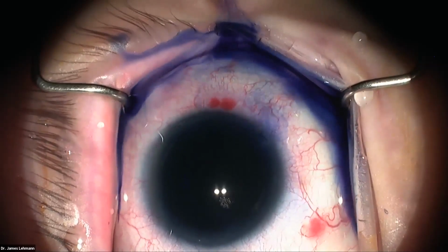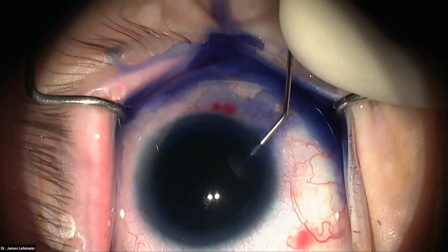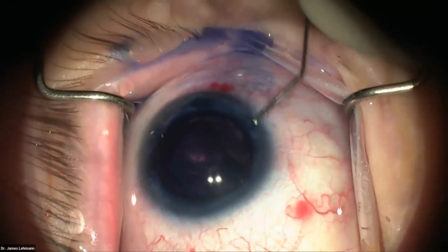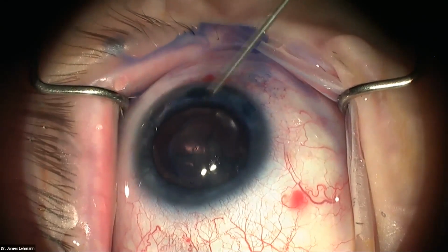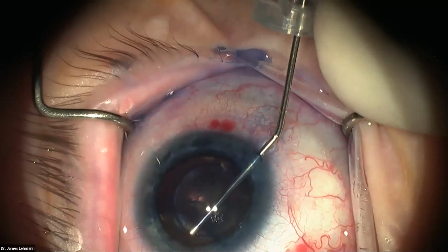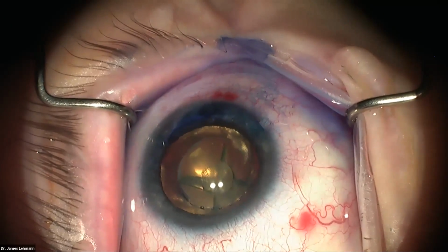So we let that simmer for a few seconds. And we're going to rinse it out. Kind of lets you see those LRIs a little better right here and here. And then we'll go ahead and use our dispersive viscoelastic. So obviously we use a dispersive for this first part to help coat the endothelium so that we don't have cell damage during the surgery. And you can see the nice curvilinear capsular rhexis or capsulotomy there. And then we're going to use a keratome.